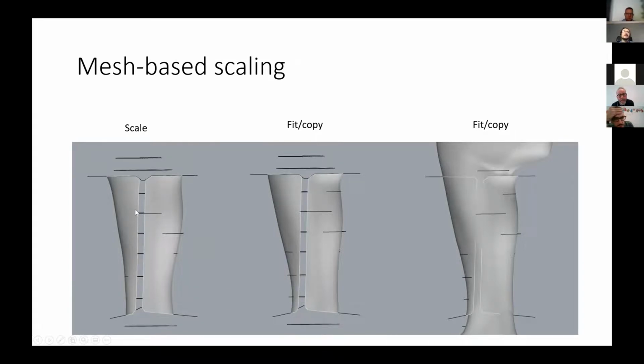So often this gives a more designed look. And the other option is to simply copy these sections from the existing leg, the leg scan, and to more or less duplicate that, not to 100%, there is some smoothing done, but we get a very close fit to the existing leg here. That obviously has been mirrored to be able to get the correct geometry.